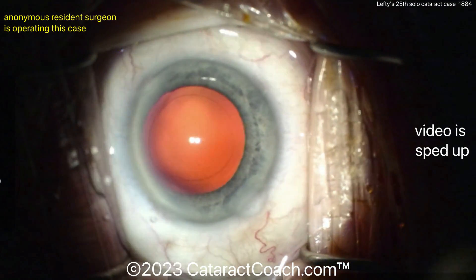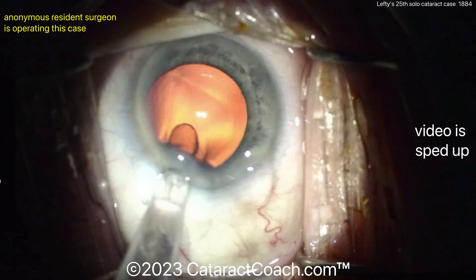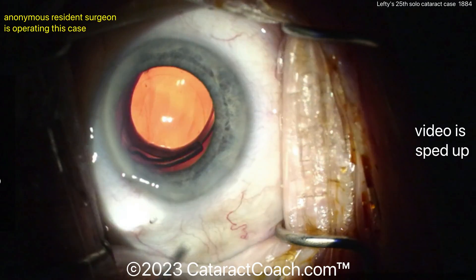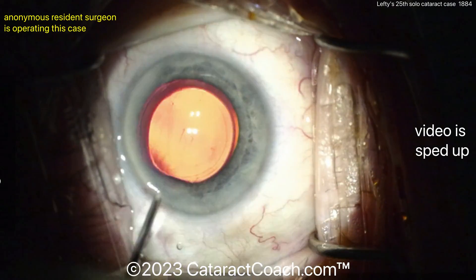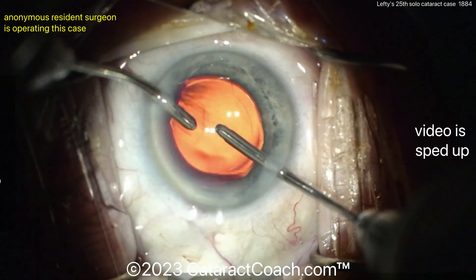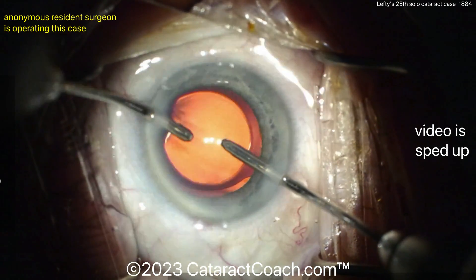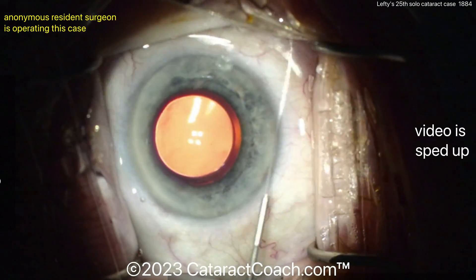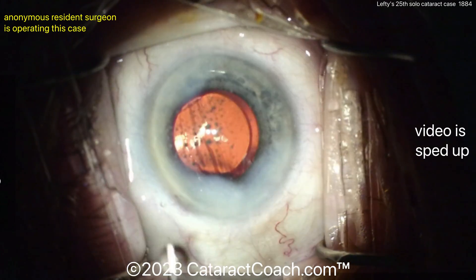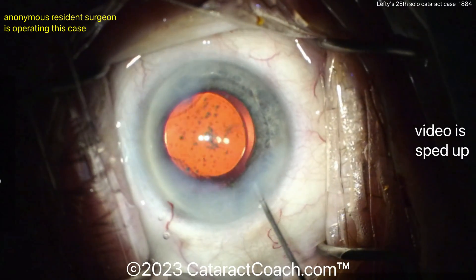Here at the end, looks like slightly enlarging the incision. Let's see what kind of lens we've got — here comes the lens. Single-piece acrylic, going in the bag very nicely. Make sure that goes in the bag — using that viscoelastic hand, that's nice, so you can inject more viscoelastic if needed. Beautiful rhexis — look at that, nice overlap 360 degrees. Now going in with the bimanual IA to clean out the viscoelastic. Maybe you can tilt the lens or get behind it. If you've done less than 100 cases, I don't mind if you don't fully go behind the optic — just tilt it, that's pretty good. Once you start toric lenses, you need to go behind the lens optic. Here's setting up the incisions — a little bit excessive on the hydration there, that's going to induce some astigmatism tomorrow. But that's a great case — for Case 25, you are doing a fantastic job. Keep up the good work, and get the eye back in primary.